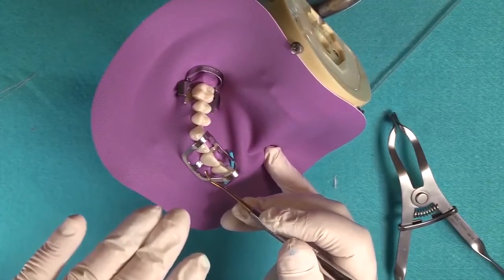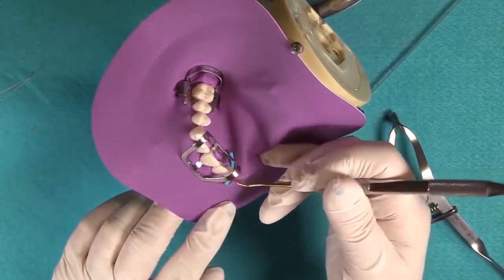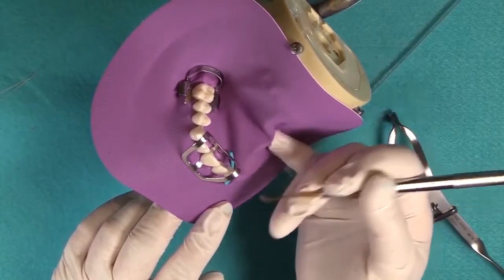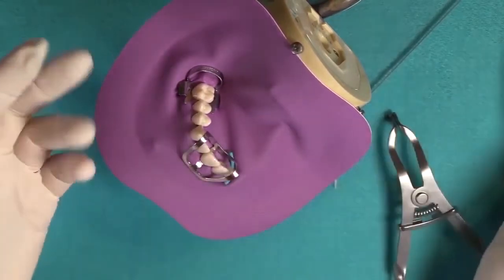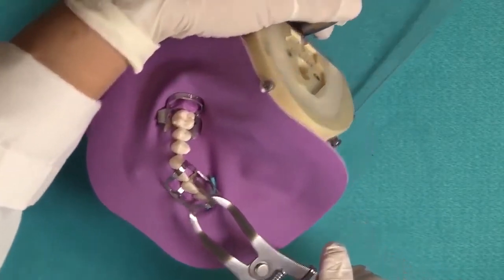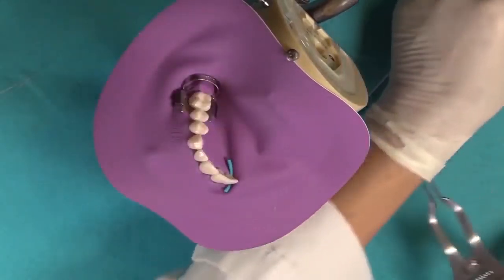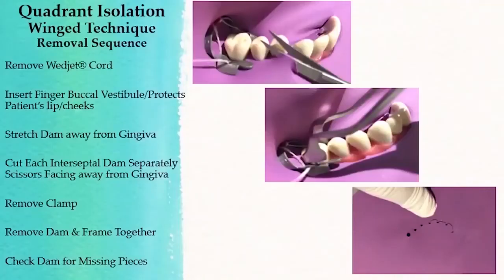We would restore it. Then if you have a compound on there, you could use a scaler and just flick the compound off with the scaler. So then you would remove your gingival retractor clamp. Again, just squeezing on the handle. There you go.